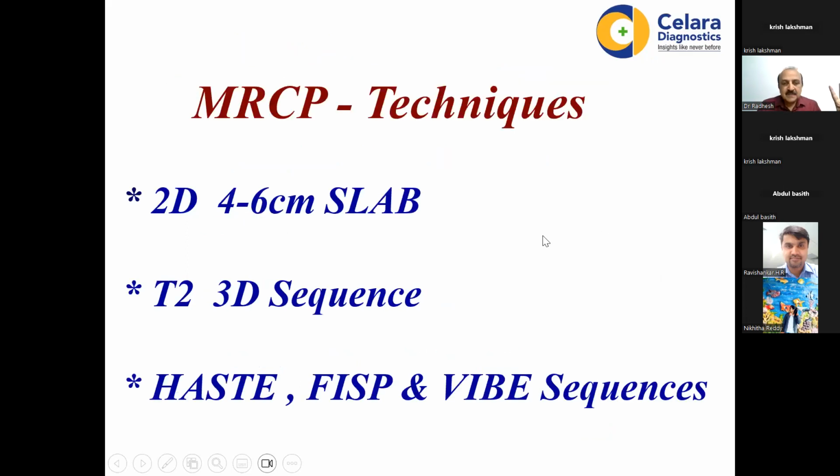Now, there are two types of MRCP techniques that we use. We use a 2D sequence and we use a 3D sequence. Now, what is the difference between 2D and 3D?